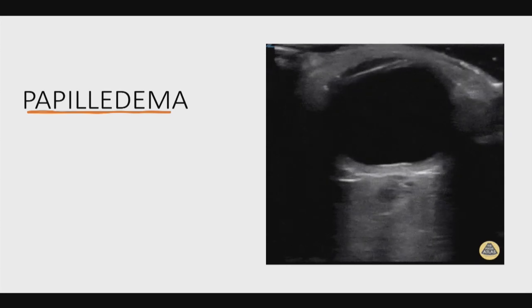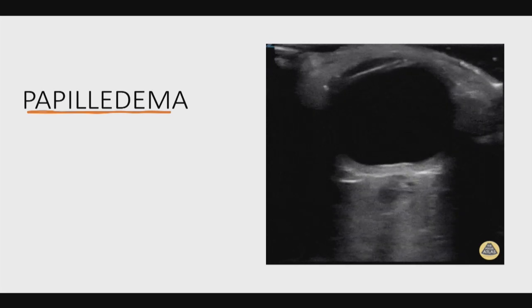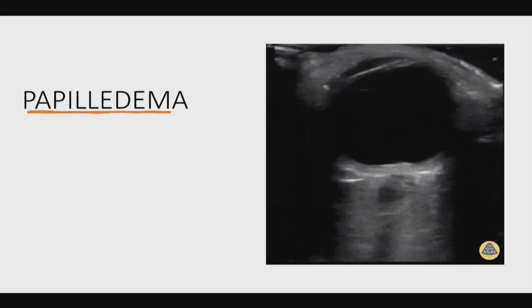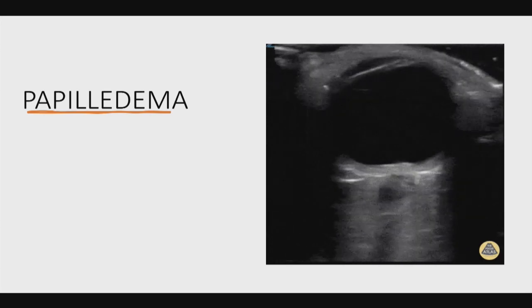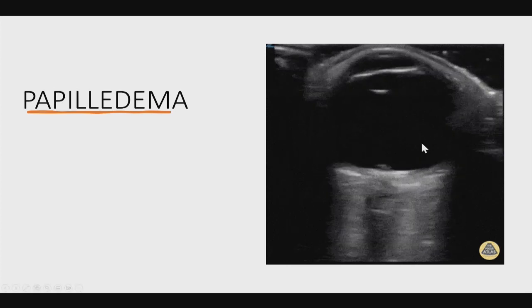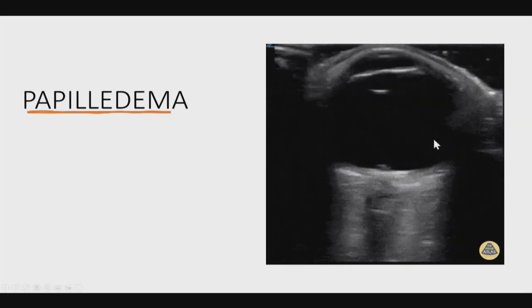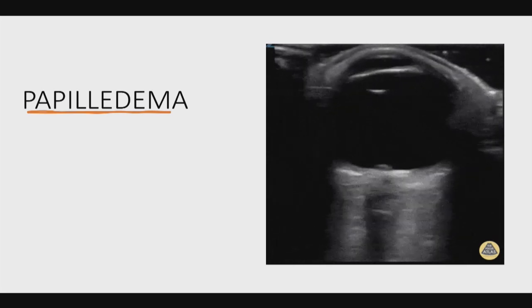Okay, so when we talk about ICP, we have to differentiate increased ICP, which papilledema is a surrogate for, from more chronic with papilledema versus more acute. If it's more acute, you would not see that elevated optic nerve head, and we use a different measurement, which we're going to talk about on the other slide. But I'll get to it on the other slide.